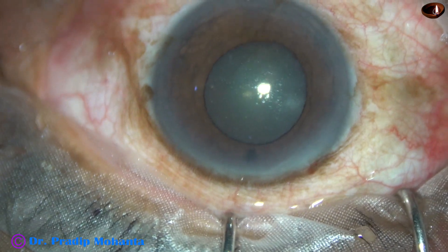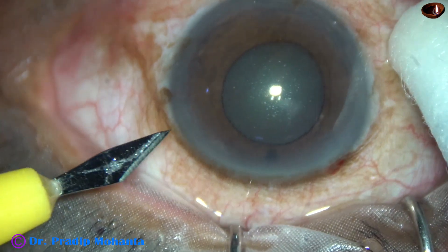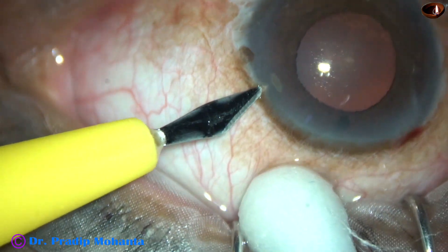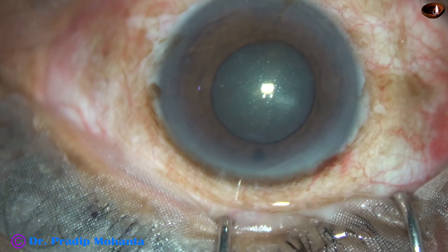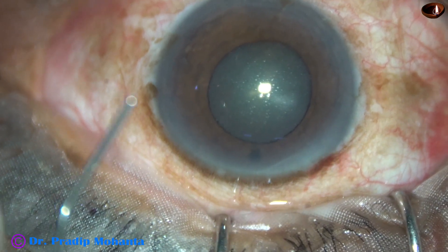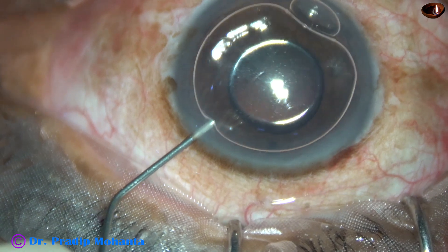The main incision has been made with a 2.8 mm steel keratome. This is a side port on the left side of the main incision. And now this is an air bubble.